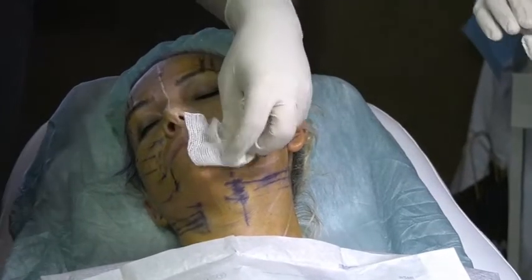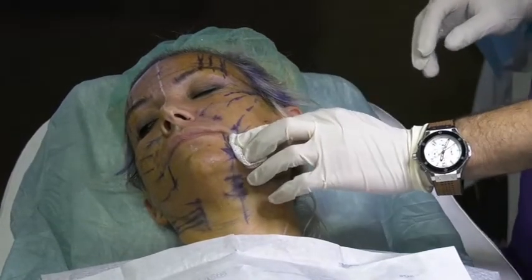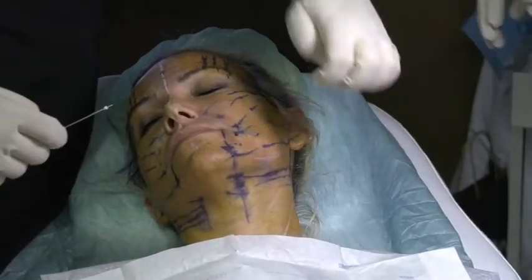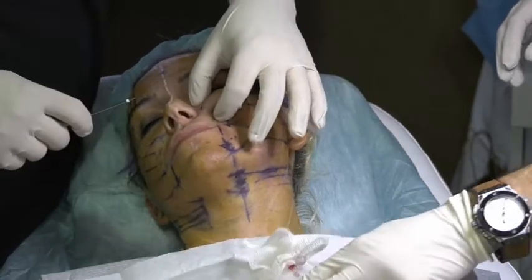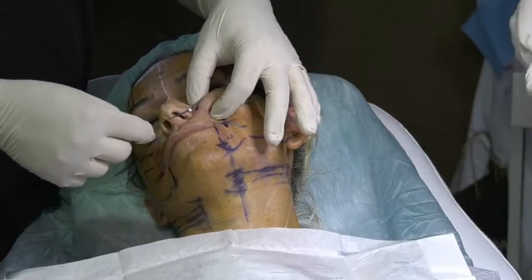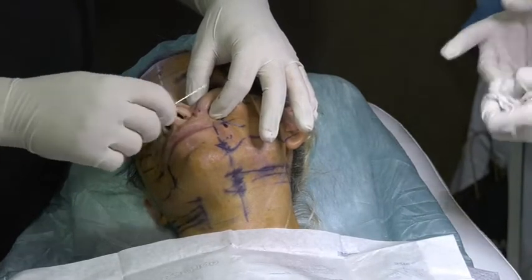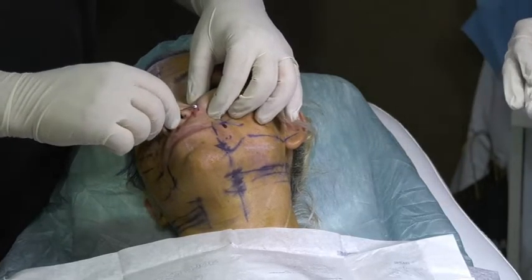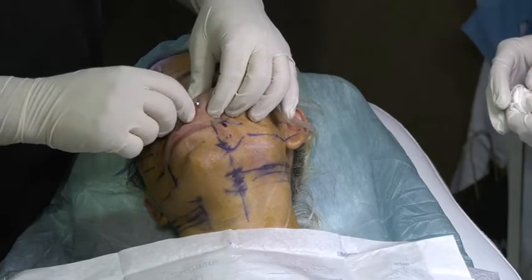First, when I enter, by the way, this is not the only right way, but this is a very easy way to work for all patients. Hold the skin exactly in your hands as what you did before in entry point, like that. This is the open part. The open part should face up, not down. This is correct. You try to find the hole. Okay? And then, this is my 20 to 30-degree angle. I push till I finish the blue part. Push, push, push. Till here.